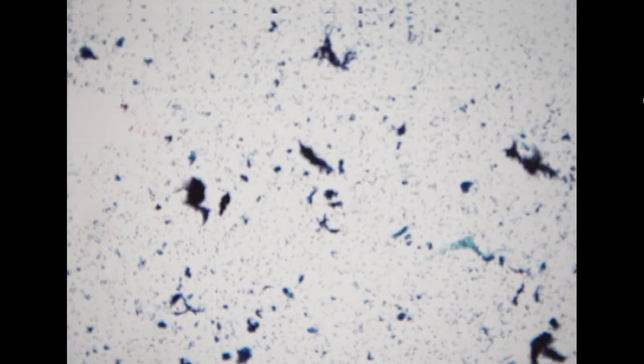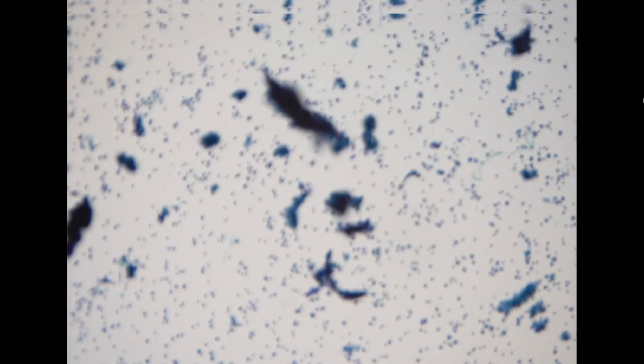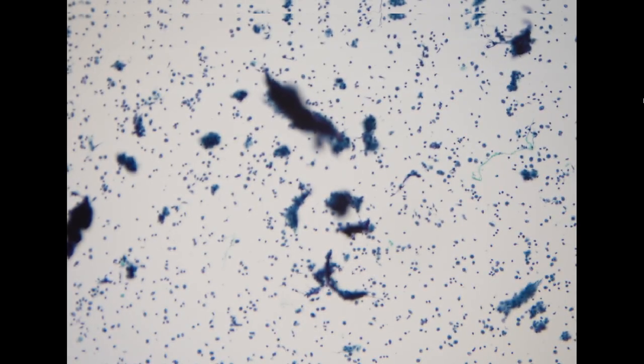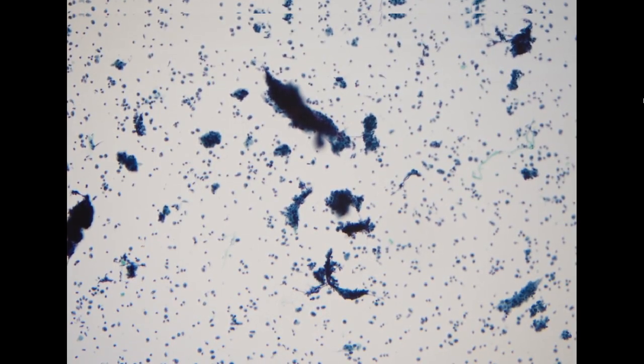So the next specimen is coming from a 64-year-old female who presented with neck lymph node enlargement and who has been followed in our ENT department for almost half a year. I think initially they used some antibiotic for the treatment, and the lymph node seemed to shrink in size a little bit, but still it was there.